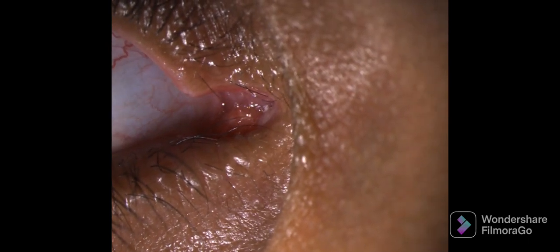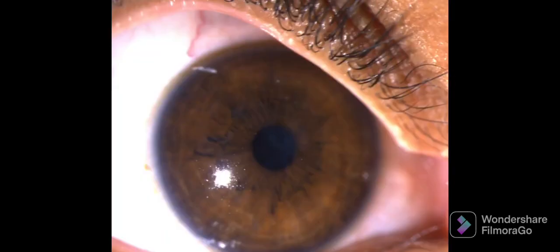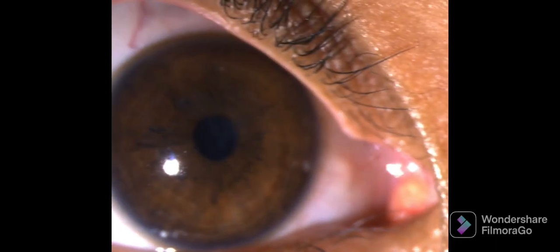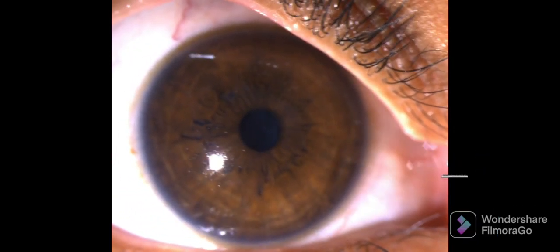It is a little difficult to visualize the upper punctum, but it can be examined under diffuse illumination. In diffuse illumination, we get an overview of the entire anterior segment of the eyeball. The last structure to be examined is the limbus.